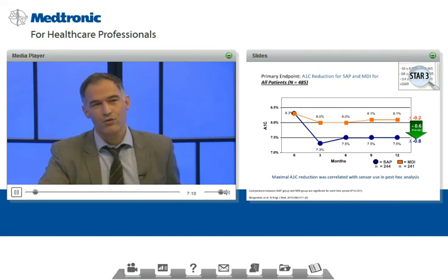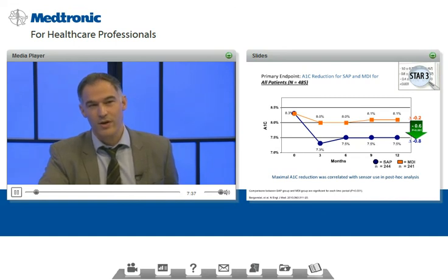In the control group were people who continued on analog-based multiple daily injections, and they maintained an A1C by the end of the study at 8.1%. But those who went to a sensor-augmented insulin pump had a big reduction of about 1% in the first 3 months and maintained that and ended up with an A1C of about 7.5%. So the incremental A1C benefit of using sensor-augmented pump therapy compared to MDI on average was about a 0.6% better A1C.